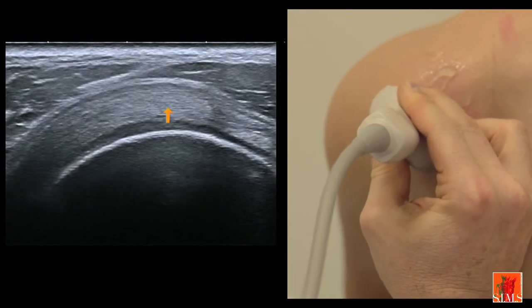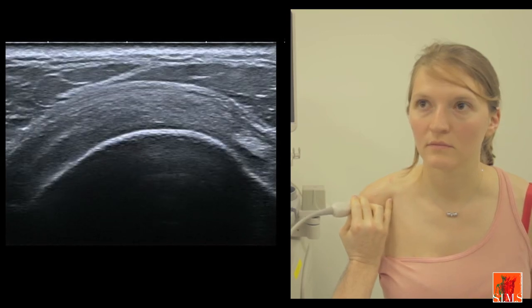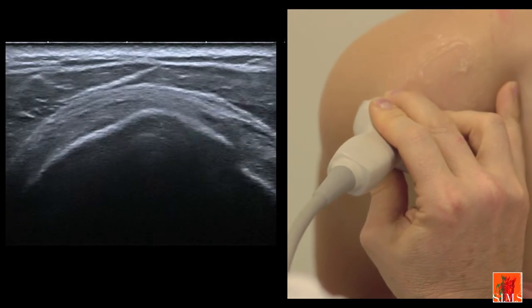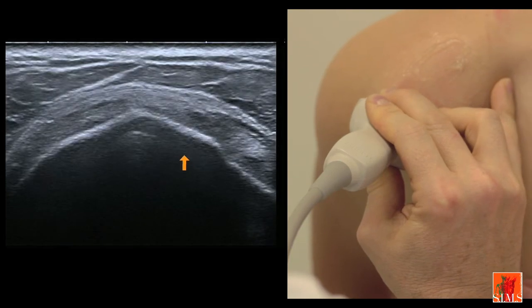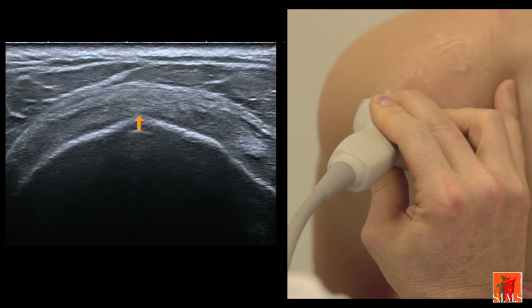Another way of locating the supraspinatus, infraspinatus junction, consists in moving the transducer outwards and in evidencing the insertion surfaces on the greater tubercle. The horizontal surface corresponds to the insertion of the supraspinatus, the oblique surface to that of the infraspinatus.